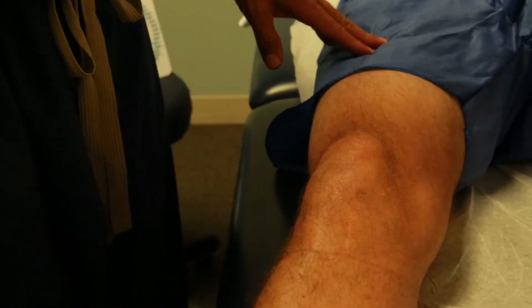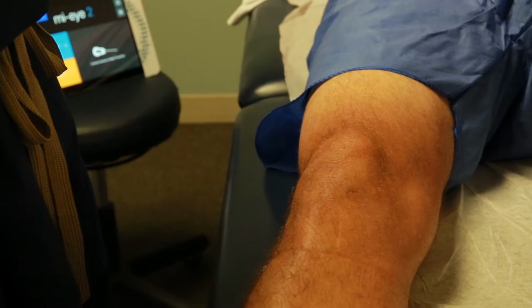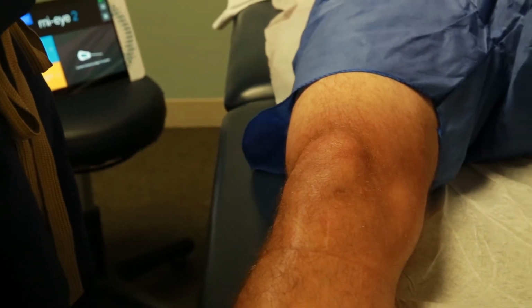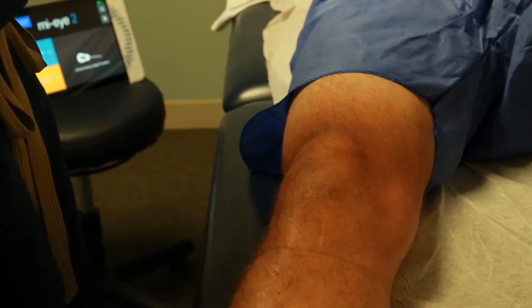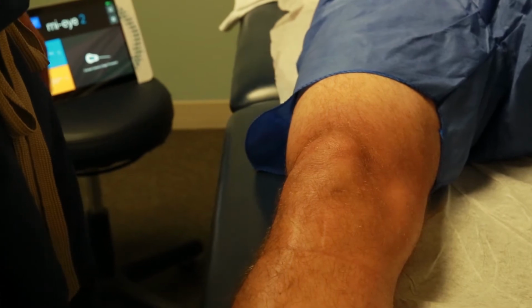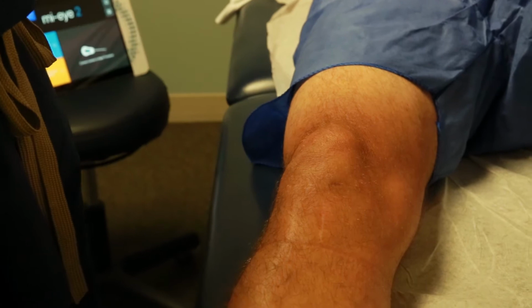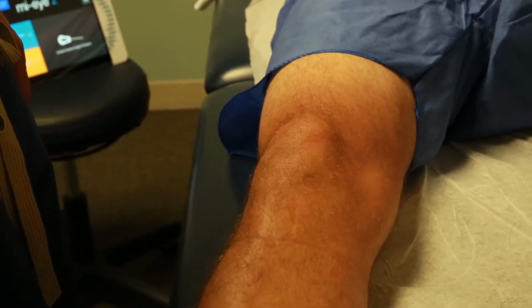So the first thing you want to do is just have the patient lie on his back. If you want to put his head up a little bit, he can. If the patient wants to watch, it's not a problem. If they don't want to watch, it's not a problem. They have an option to watch the screen alone or just watch nothing. Our patient here has decided he doesn't want to watch anything, just wants to relax, so he's lying flat on his back with his head on the pillow.